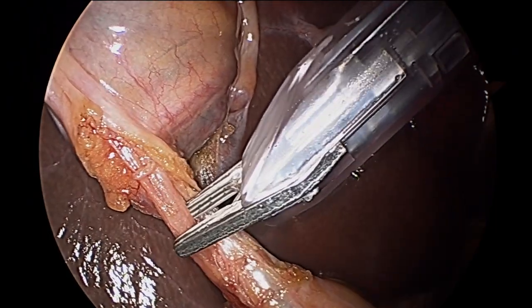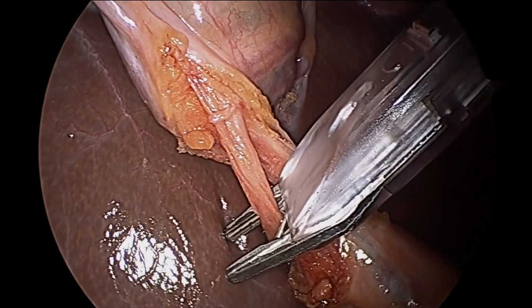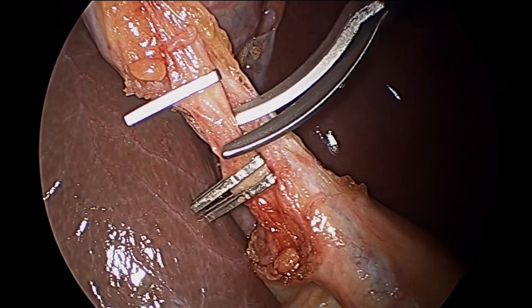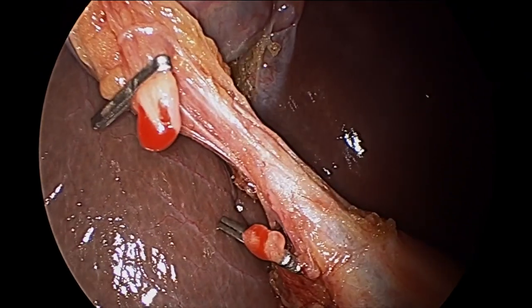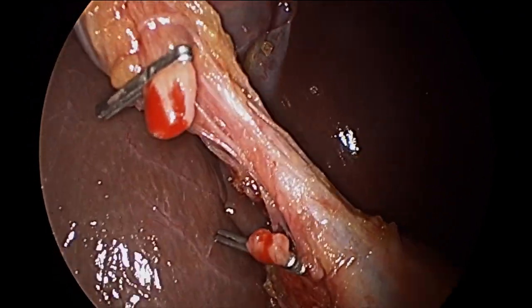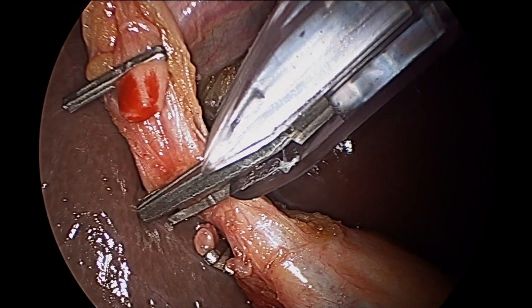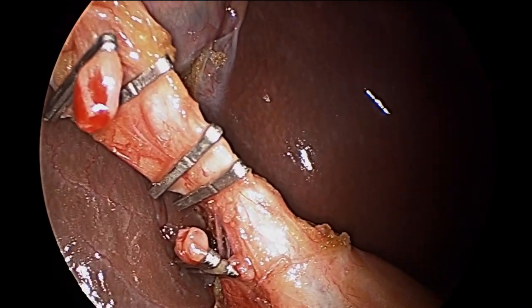Now once that dissector has identified all the branches, she introduces surgical clips on the anterior, or the front branch of the artery. This will seal off the artery. You'll see a clip here, and then a clip above, and that seals off that anterior or forward branch. These are surgical scissors that will cut the anterior branch. Now we introduce the surgical clips again and isolate that center structure — one clip there, and then one more above, and repeat the process with the scissors.